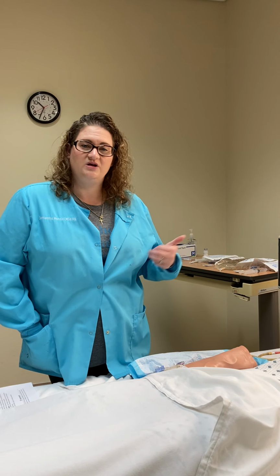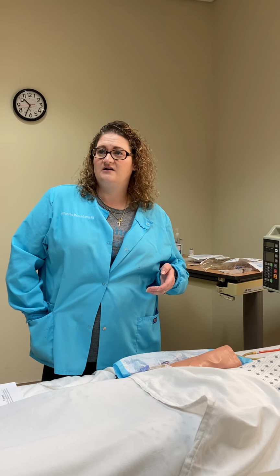The purpose of the IV therapy could be for replacing fluids, electrolytes, vitamins, of course, delivering different types of medications, antibiotics, and treatments, maybe for autoimmune diseases or chemotherapy type things. 90 to 95% of our patients in the inpatient setting are going to have IV therapy sometime during their visit.